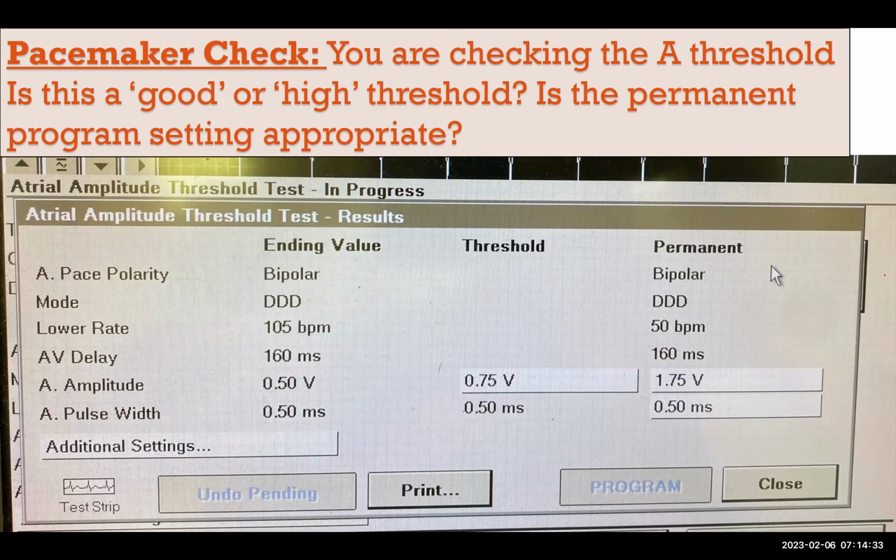So again, just to remember, the pulse width is how long the energy is being delivered. And in the bedside pacemakers, we do not have control over the pulse width. Just so you understand, the pulse width on those devices is a little less than 2 milliseconds, so it's about 4 times the pulse width of this device. You can see that whoever designed those was cognizant of the fact that temporary wires don't have great contact with the heart, so it's jazzed up with a lot of energy. The longer you deliver the energy, up to a point, the lower the threshold, the less energy you will have to deliver to capture the myocardium. In other words, if I had set the pulse width in this test to 1 millisecond instead of 0.5, the threshold might have been 0.25 volts.